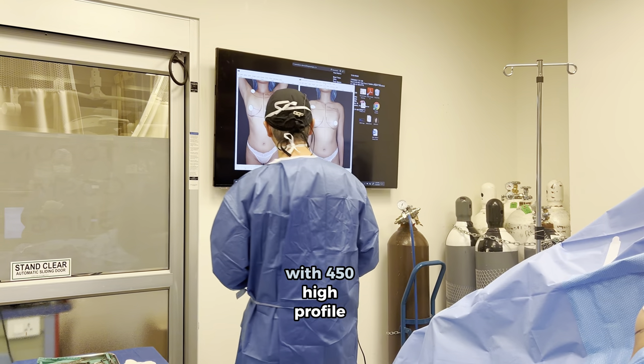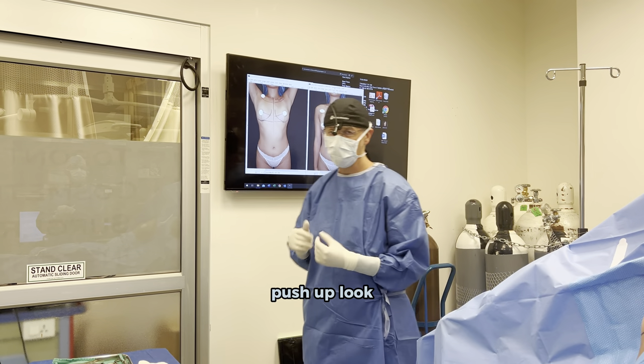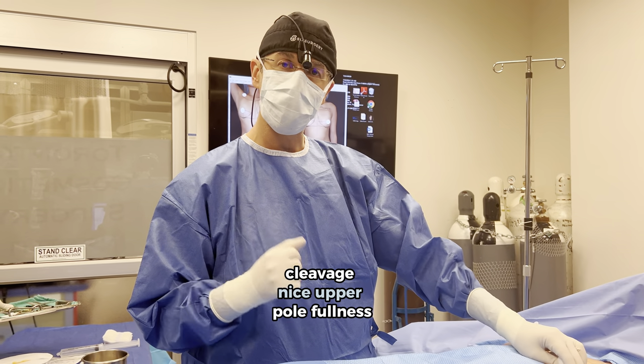Up next we'll be doing a breast augmentation — 450 high profile silicone breast implants. She wants to go for a rounder push-up look. We're using the power boost approach to give her nice cleavage and nice upper fullness.